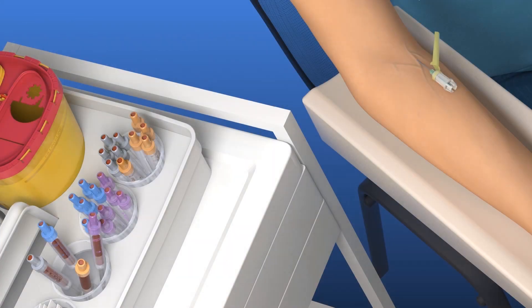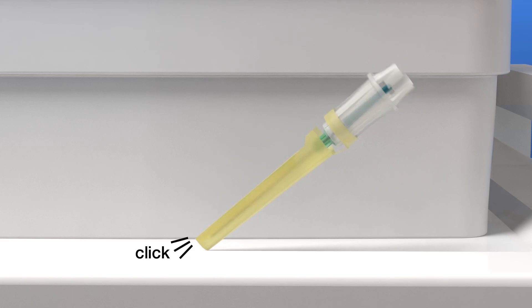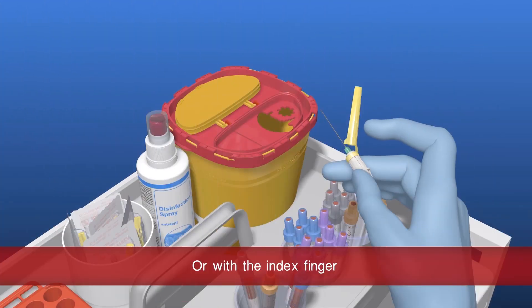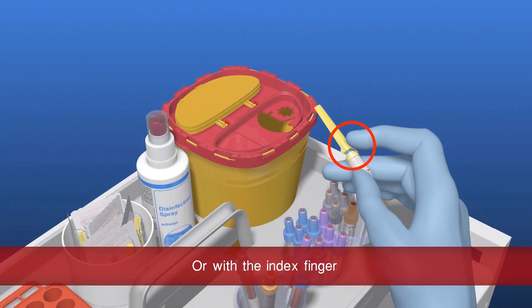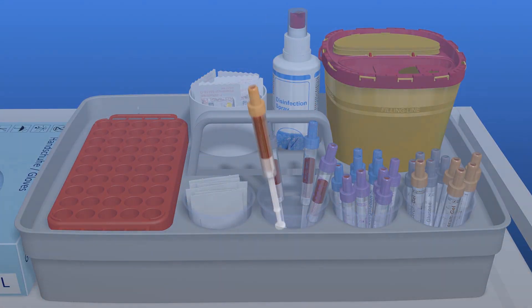Remove the safety needle and apply pressure with the swab onto the vein. The needle protector can be activated with one hand on a stable surface — the needle engages audibly. Alternatively, you can also activate the needle protector with your index finger. Discard the safely locked safety needle in a sharps disposal box.